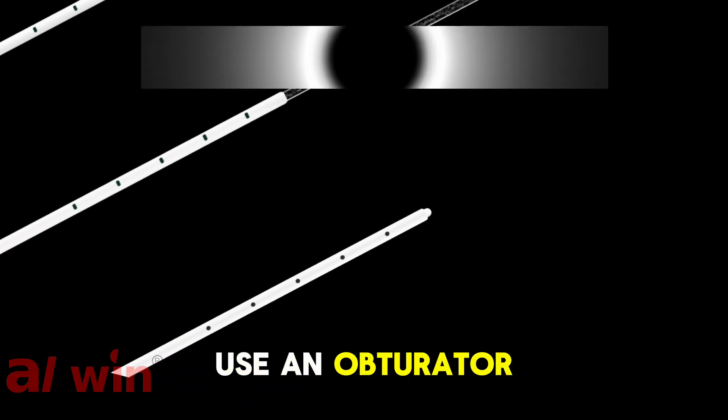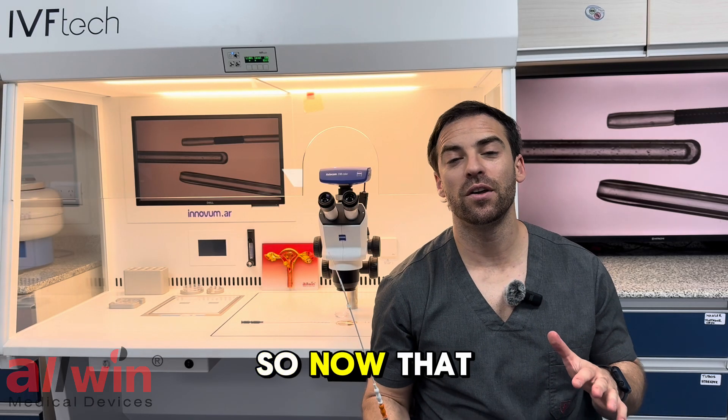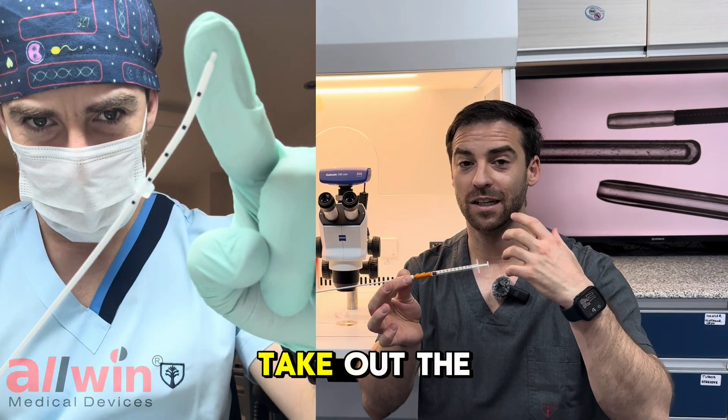As an option, we can also use an obturator to enter the cervix without dragging cervical mucus. Now that we are in position, we're going to introduce the inner part — but of course, don't forget to take out the obturator.